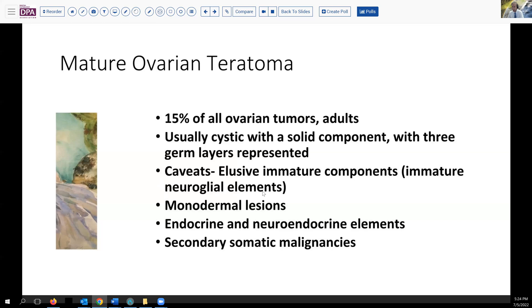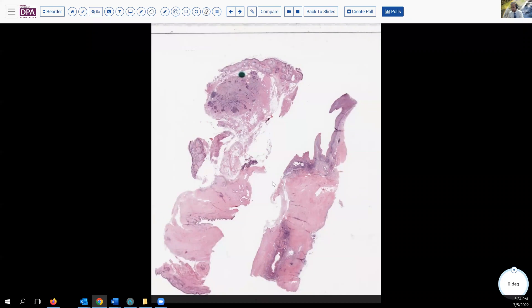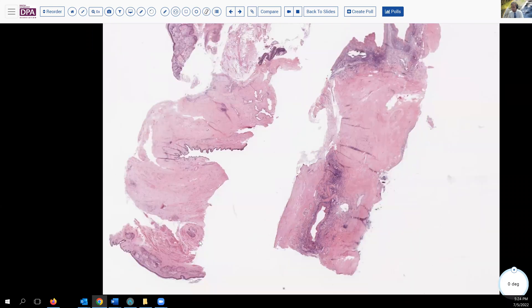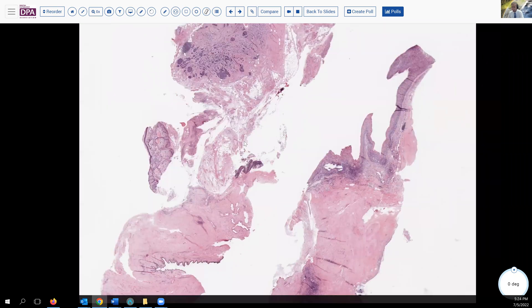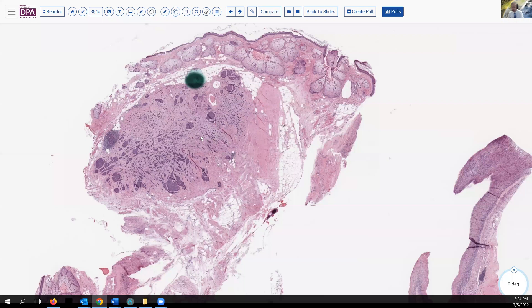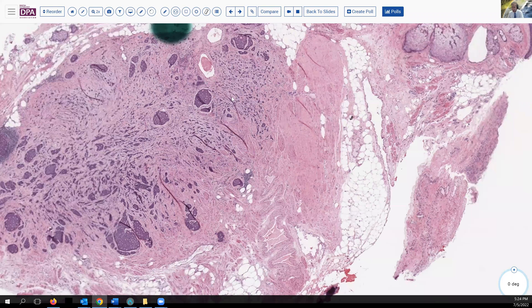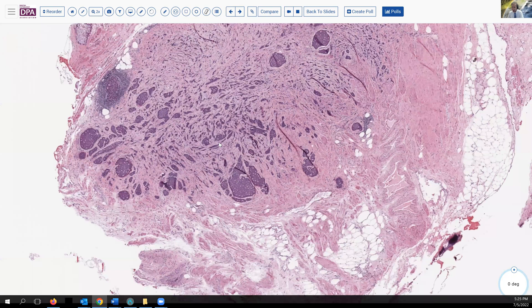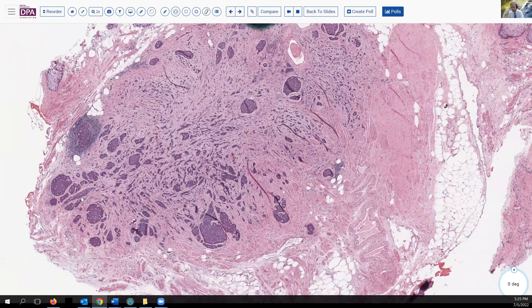Very justifiably, my colleague was wise in looking for any evidence of neural glial components. Here are the permanent sections, as you can see. It's not difficult confirming the sebaceous element here or the epithelial element, but is this neuroectodermal? There are a couple of things that should alert us to say probably not. First of all, these nests have very sharp borders. With the exception of one with a little lymphoid inflammation, these are all very sharp nests. In addition, there is this insular or island infiltrative pattern to the lesion, which looks much more like the neuroendocrine tumor that, in fact, is what this is.